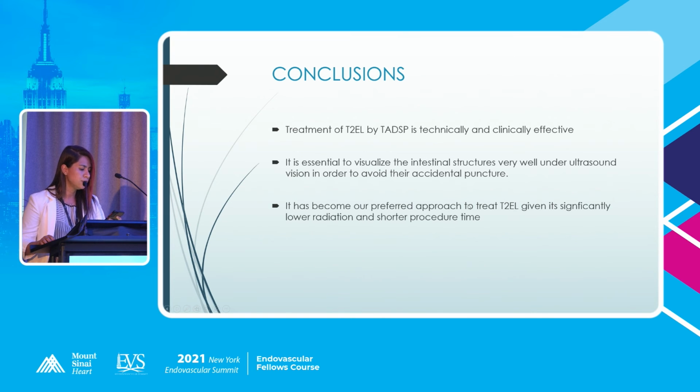At the end, in conclusion, this treatment is technically and clinically effective. We have to be very conscious about the risk of puncture of the intestinal structures, and we have to visualize them very well to avoid accidental punctures. And now, in our experience, we prefer this approach to treat this type of endoleak because it's more cost-effective and it's shorter in time, and we receive lower radiation with a very good result for the patients. Thank you very much.